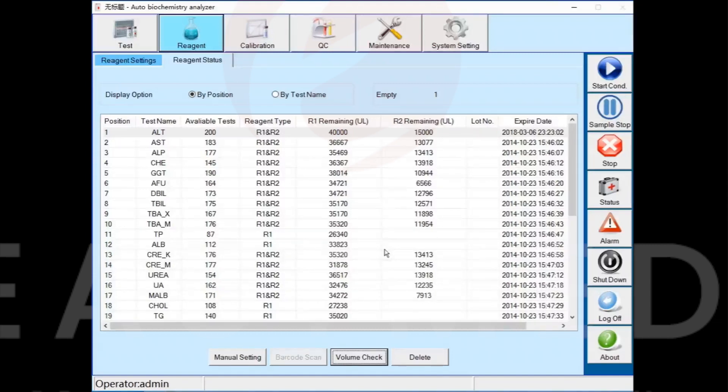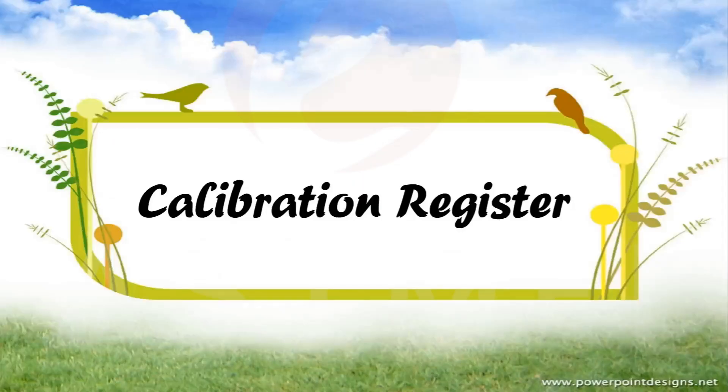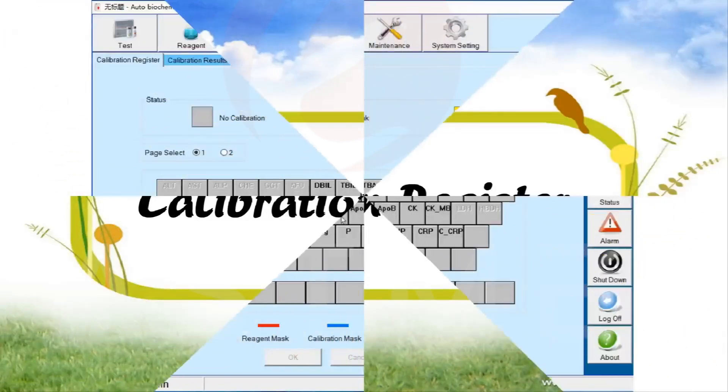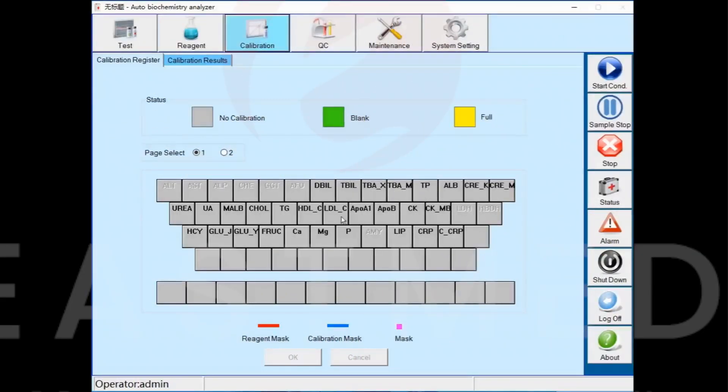Sixth part: Calibration Registration. Go to the Calibration interface to register.